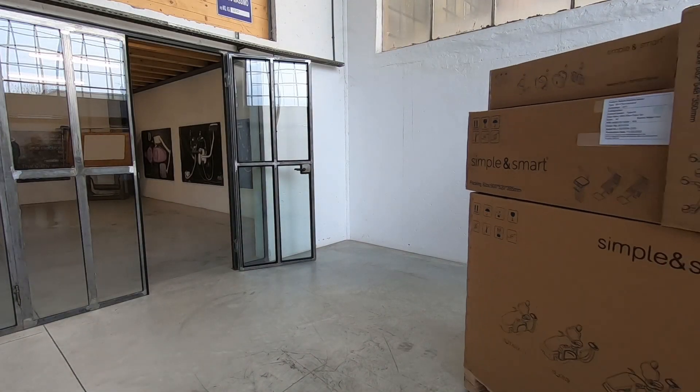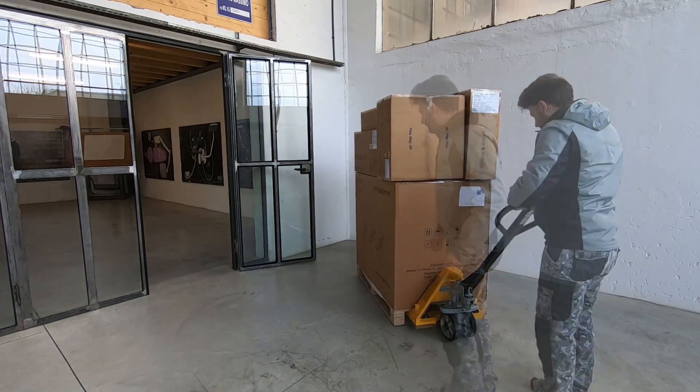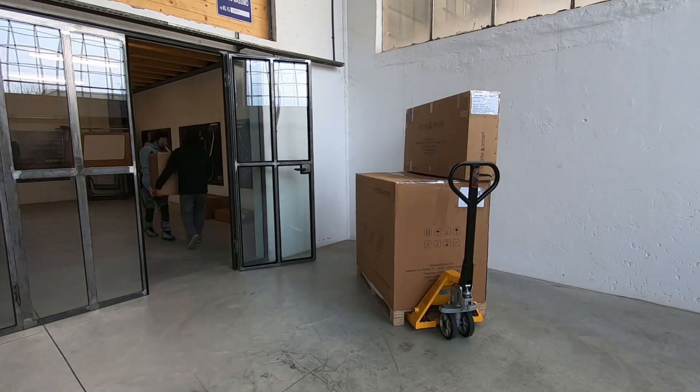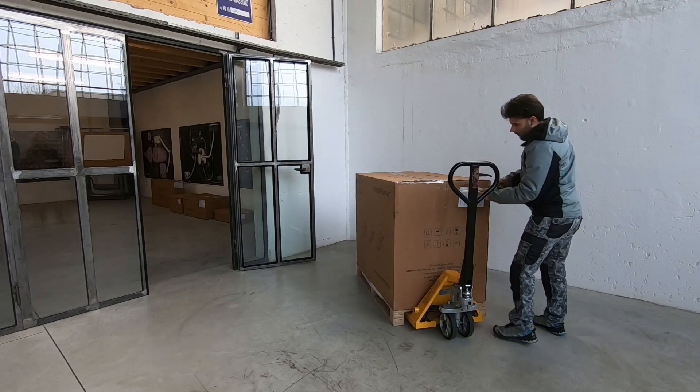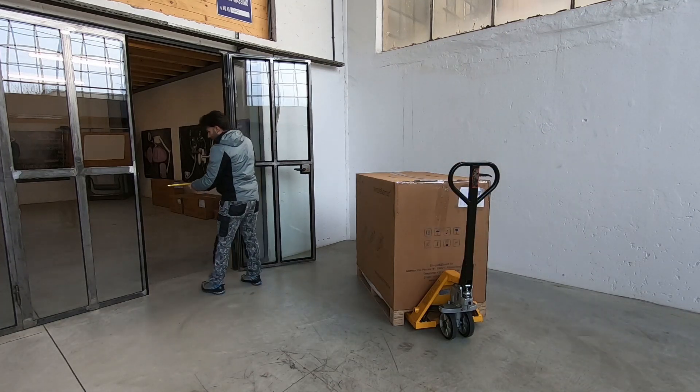This is the new Simple & Smart Dental Units Packaging. Before bringing the unit inside the clinic, check if it passes through the clinic door.